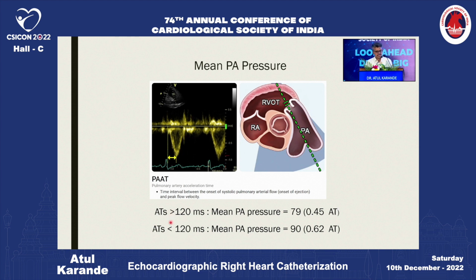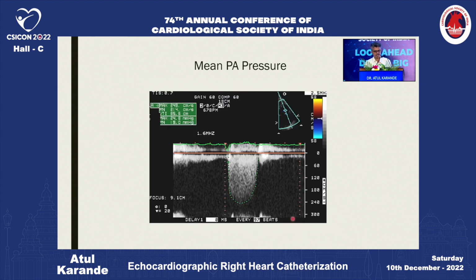If the acceleration time is more than 120 milliseconds, then this formula is used to measure the mean PA pressure, and if acceleration time is less than 120 milliseconds, this formula should be used to measure the mean PA pressure.